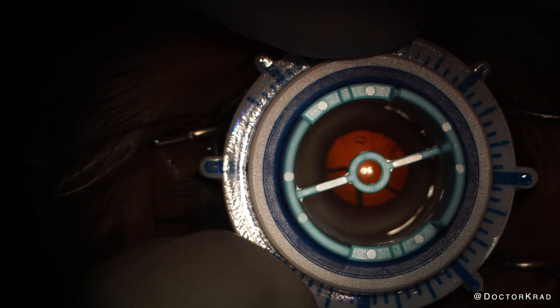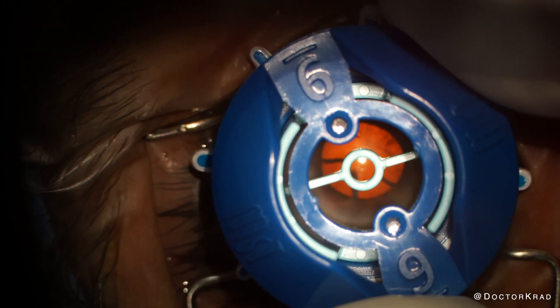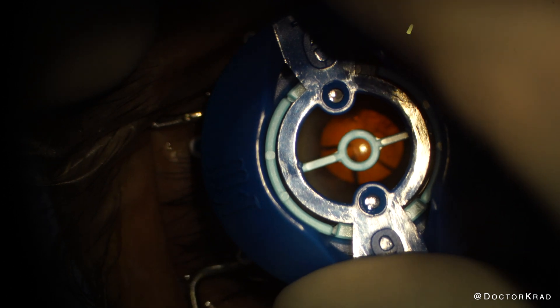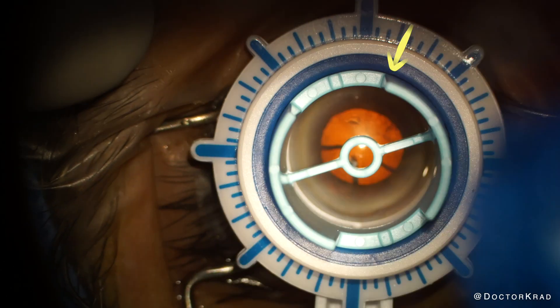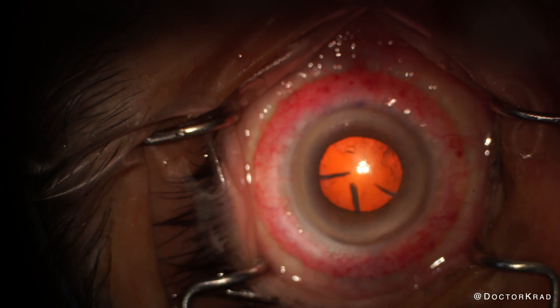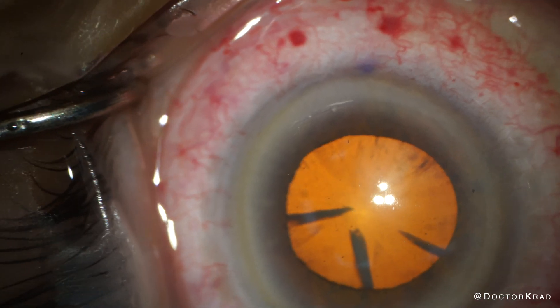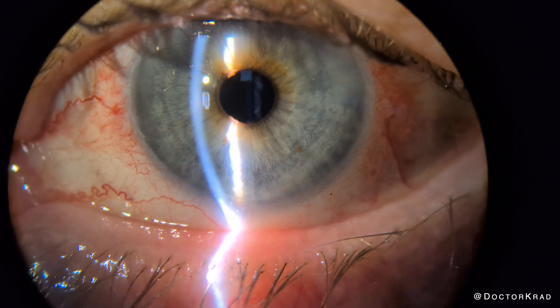I align the suction ring level on the eye and then tell my scrub tech to apply suction. I then place the blade within the template, starting all the way on one side of the template, and then rotate to the other side. Release suction, and I'm done. Super quick and easy. I'll zoom in so you can see it — a beautiful arcuate. Here's how it looks at the slit lamp. Beautifully curved like a laser.